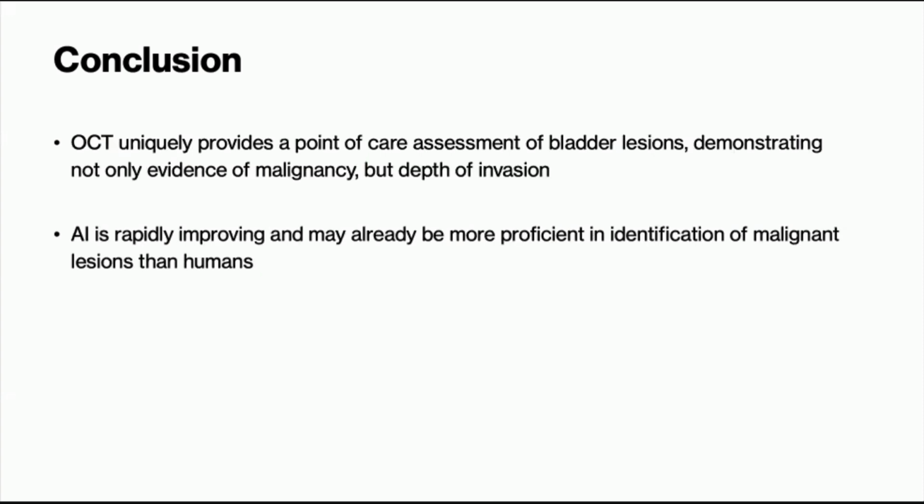But beyond that, some of the more emergent technologies, OCT, it potentially promises a future in which you're able to do a point of care assessment of bladder lesions, demonstrating not only evidence of malignancy, but also potentially depth or grade. But obviously, we need further prospective comparative trials before we're really able to assess the adoption of this as a reliable diagnostic modality.